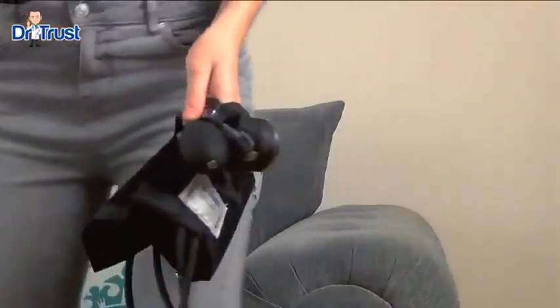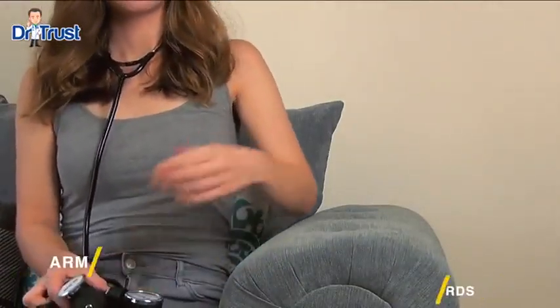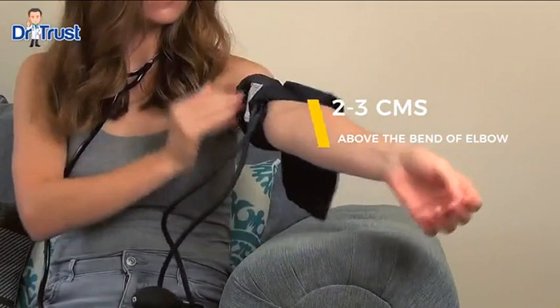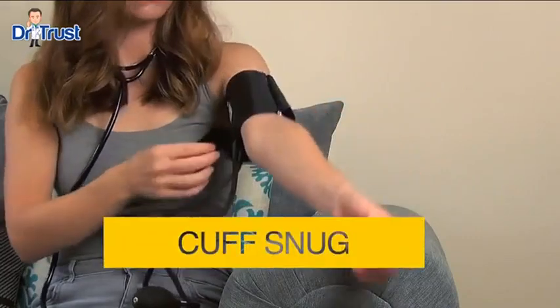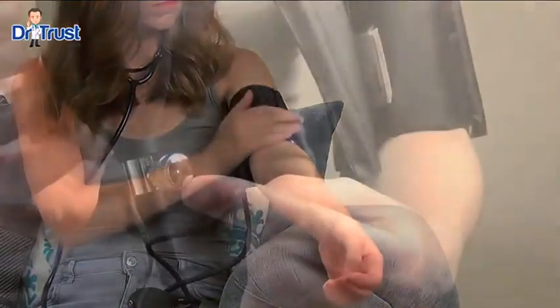To get started, sit comfortably in an upright position, resting your arm beside you at heart height, with your palm facing upwards. Slide the cuff into position, about 2 to 3 centimeters above the bend of your elbow on your left arm, and fasten securely. The cuff should be snug, but not too tight. You should be able to fit 1 or 2 fingers between the cuff and your arm.